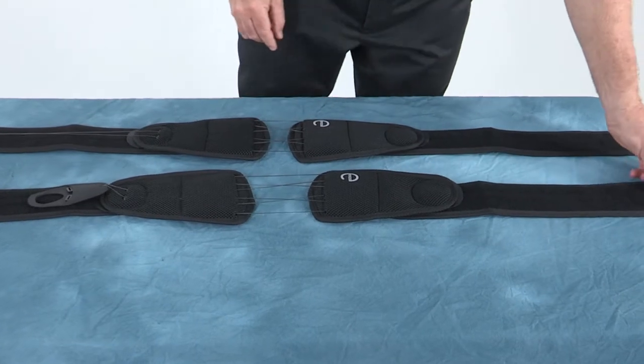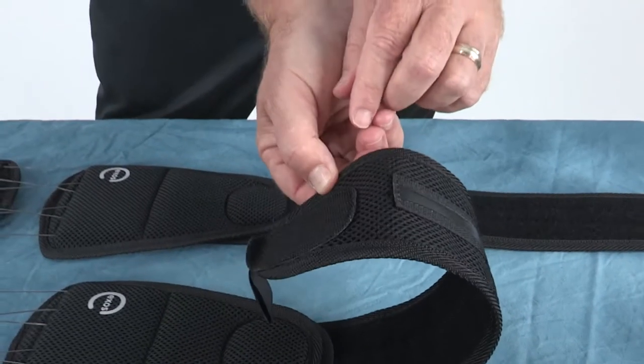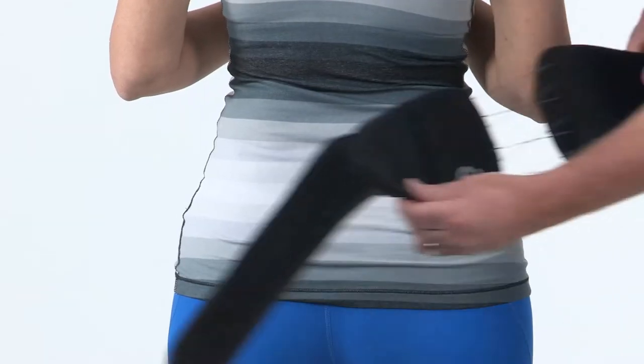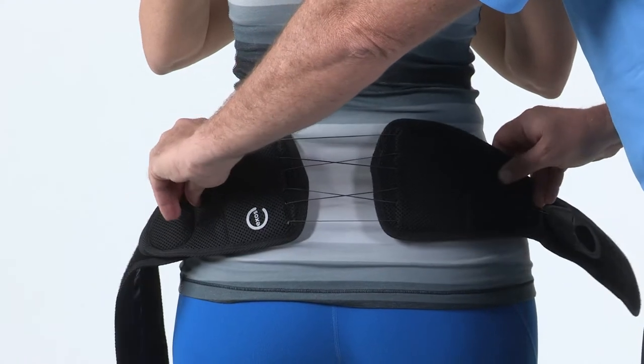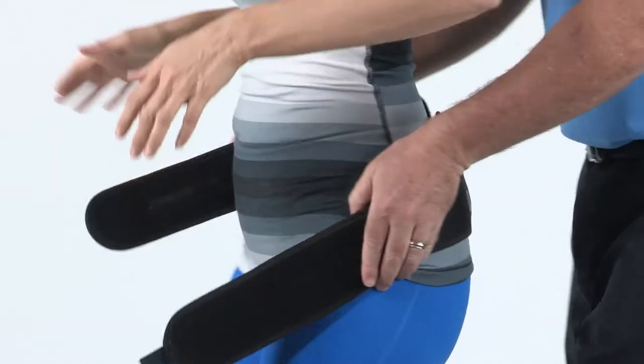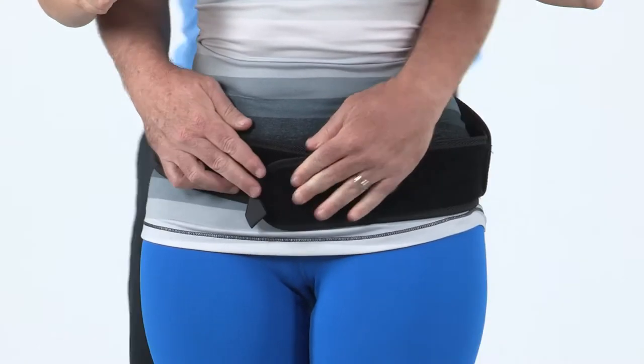To fit the SI belt, center the posterior section at the patient's midline so that the bottom portion of the brace is just superior to the crease in the buttocks. Wrap the belt wings around the patient just above the trochanters or the widest part of the hips, and attach the hook and loop connection on the front of the patient.